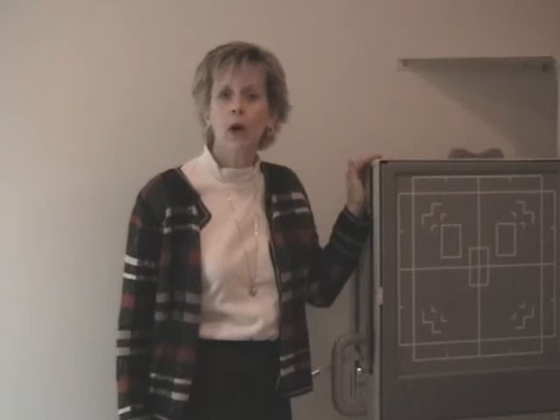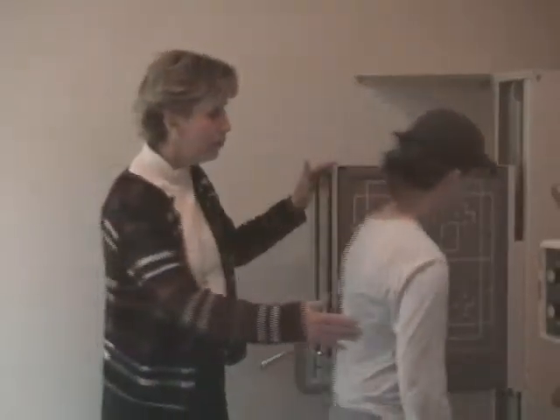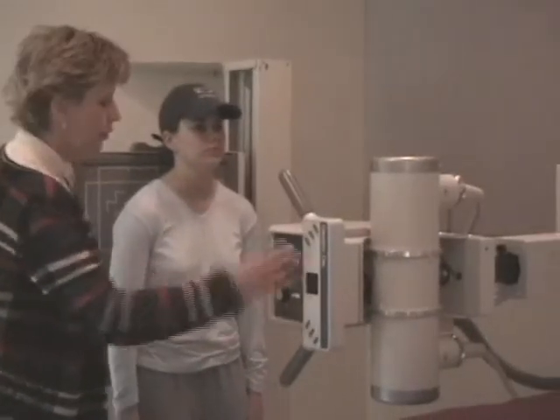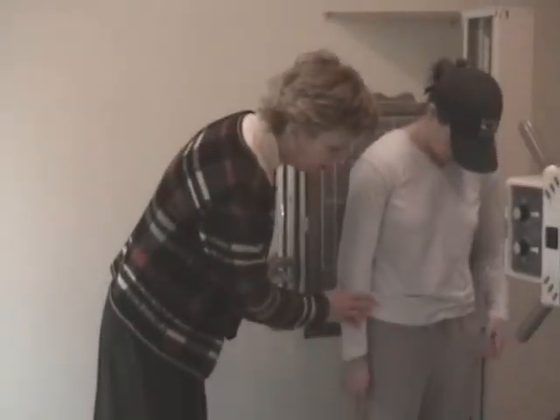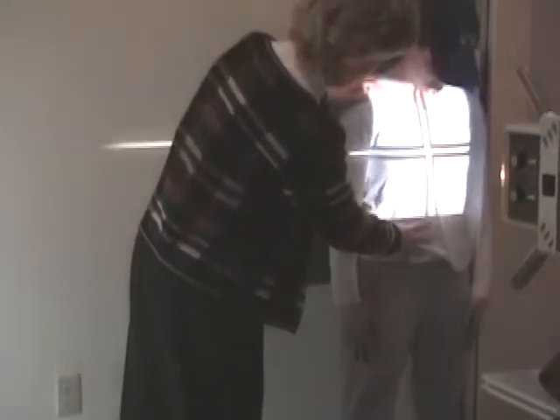protocol. So our patient was for a PA chest, and now we're going to have her come and step in front of the board for the AP abdomen. I changed my SID from the PA chest from a 72 to the 40 inches. And I have my patients stand with their feet slightly spread apart so they're stable. MSP will be to the center of the film. And I'm going to lower my board.